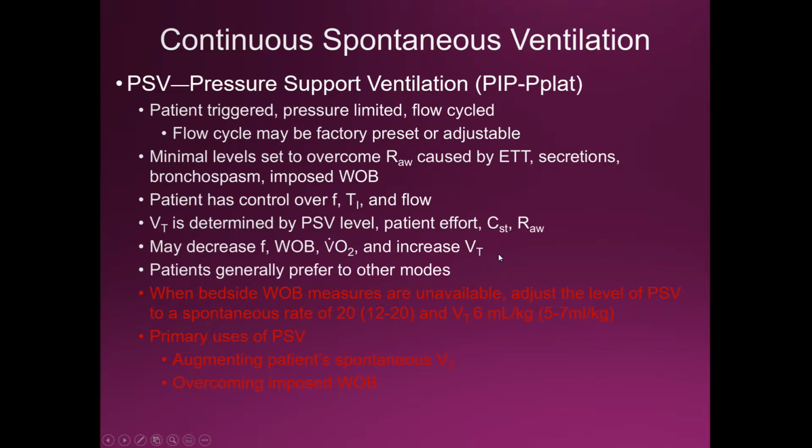All right, so if I got switched from AC to SIMV and I'm breathing with my diaphragm for, let's say, the first time, my tidal volume is going to be low. Why? Because my diaphragm muscle is going to be weak. So as the nerve innervates the muscle, it may not innervate it very well or very little, right? Because maybe I was sedated all that time when I was in AC. So I went on a sedation vacation. They saw that I was breathing better, so they switched me to SIMV. Well, my tidal volumes are probably going to be low.